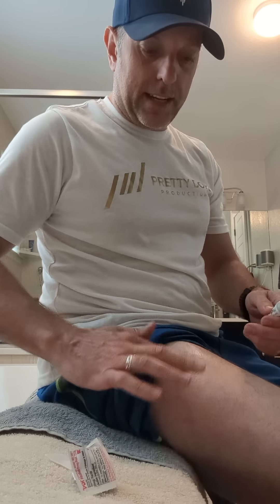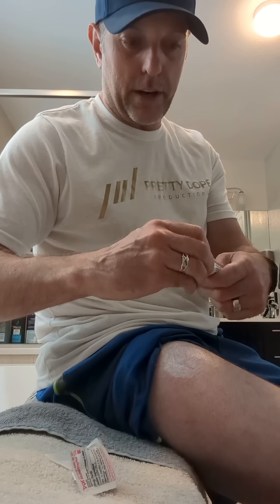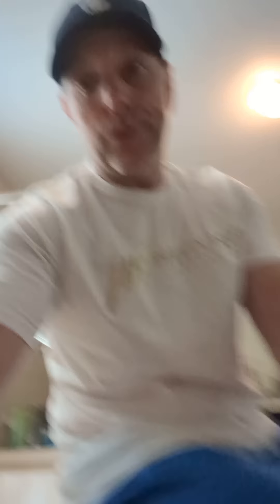The first couple times I did this I had some hives break out for the next couple of days, but it's pretty minimal. I rotate legs — this week was right leg and I'll do it next week on my left leg. So that's really all there is to it. It doesn't feel great — it does feel bad, I ain't going to lie. But anyway, if you're struggling with this, obviously talk to your doctor, and just wanted to show people what it was like to take a dose of Dupixent.